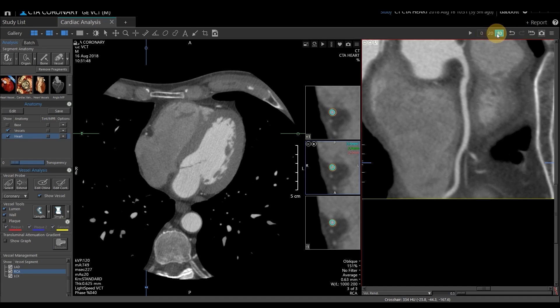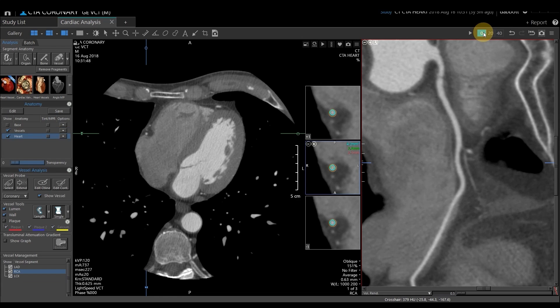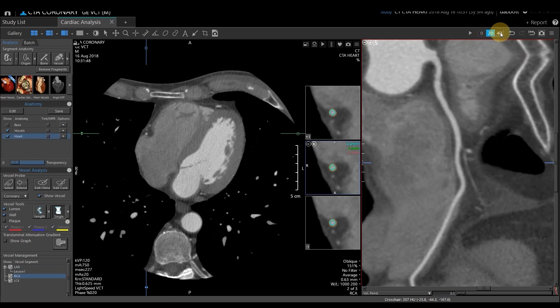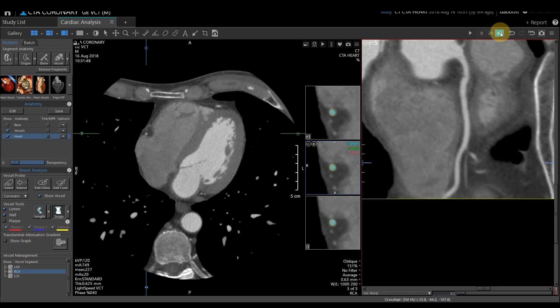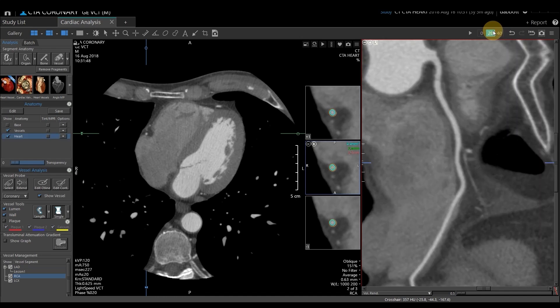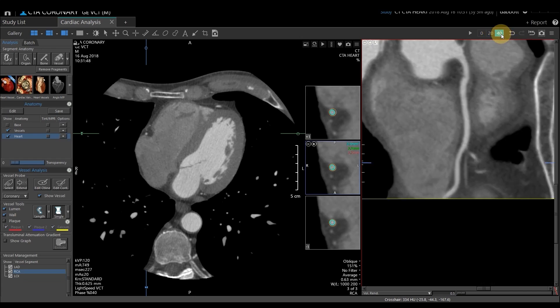Now, if we look at this particular phase, the RCA did not track as far as it did on the other two vessels. You could investigate the RCA in a different phase in that circumstance, or we can go through and check to see where Vitrea stopped — and if need be, we can also extend that vessel.